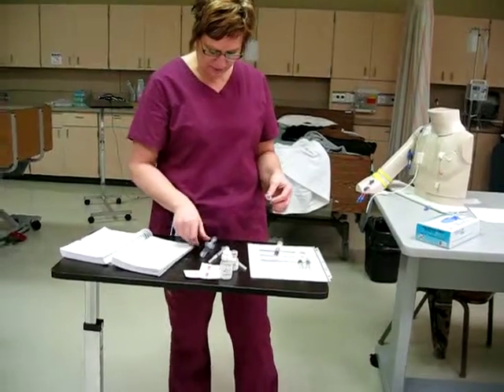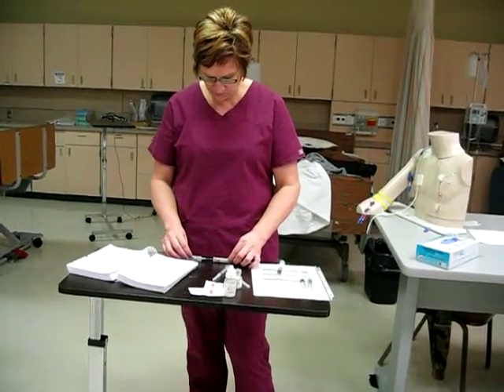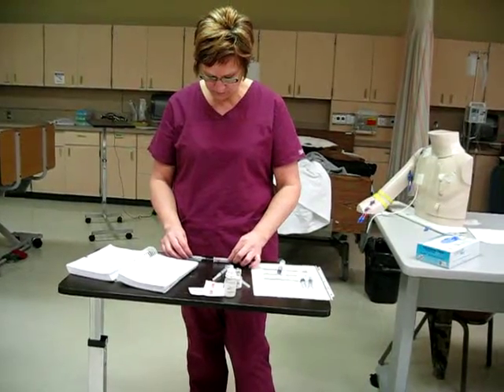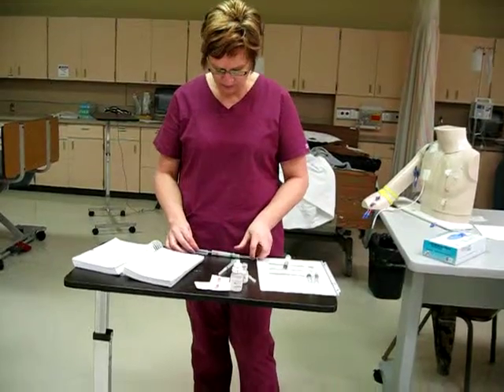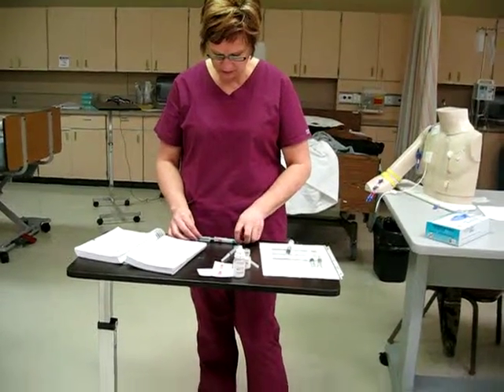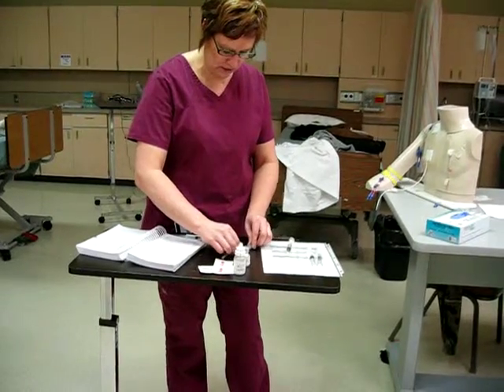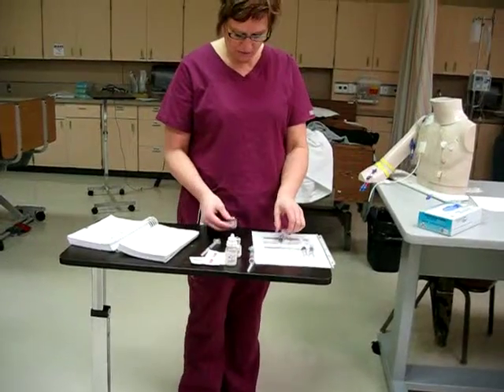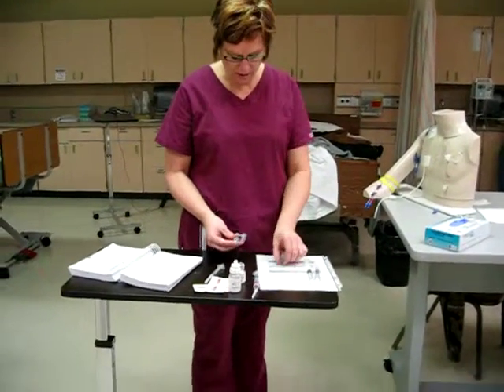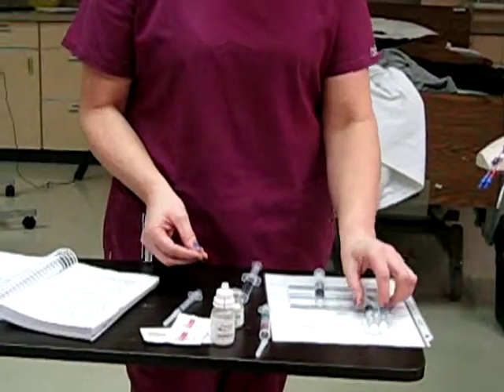Okay, and then I got to put that into an empty 10 milliliter syringe. Okay, so I have my 5 milliliters of my drug Dilaudid and my heparin and then my 2 flushes.